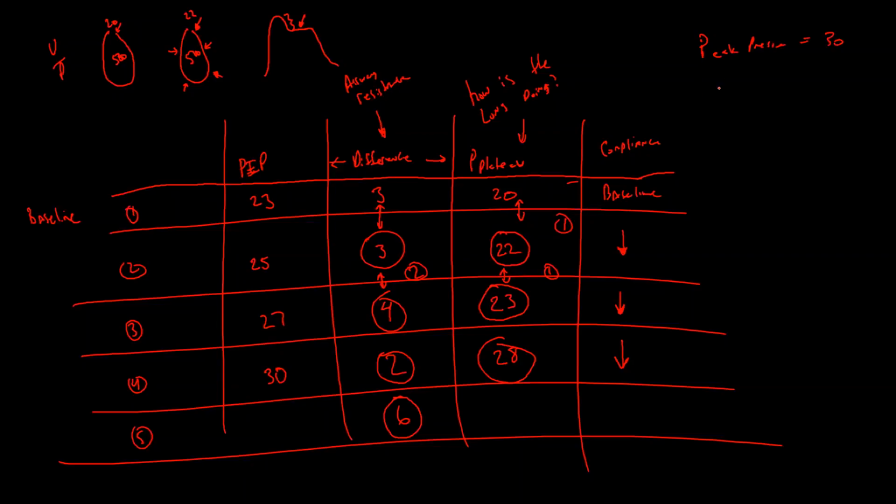Your plateau equals 28. And what they'll do is they'll have different times, say you had a ventilator check at 8, 9, and 10, and they'll have these numbers. Absolutely, that's what they do. And so you're going to have to determine on your own, without any coaching from them, what the difference is.